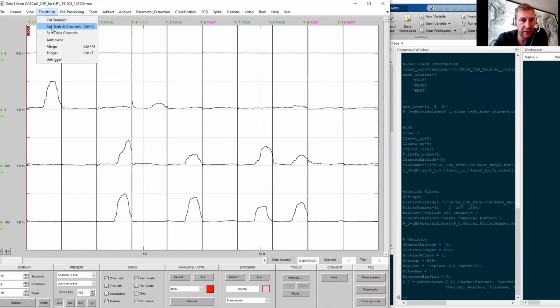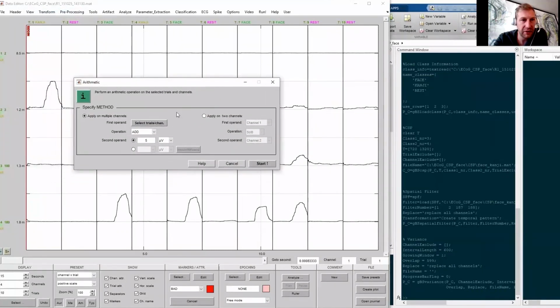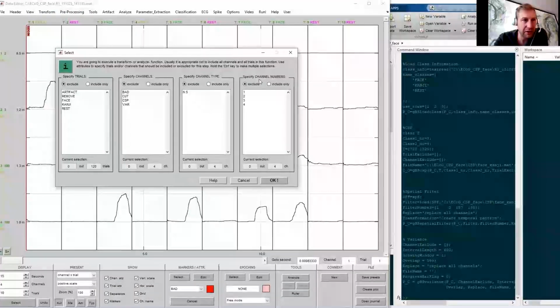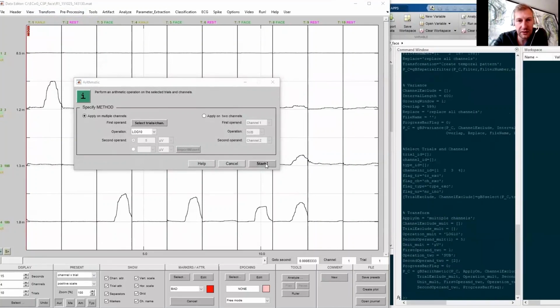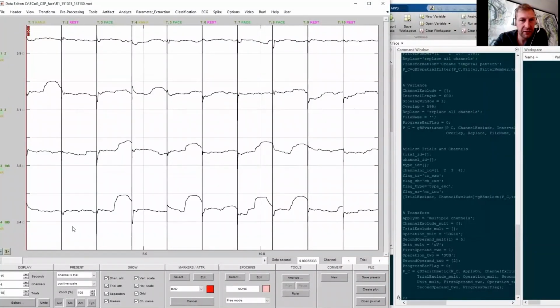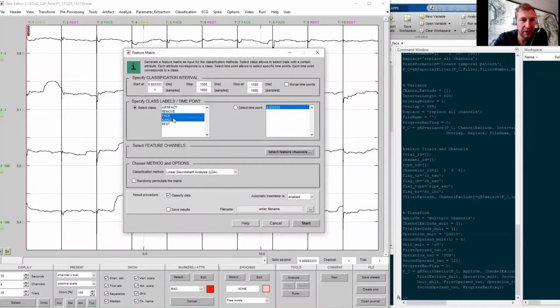And these channels are now representative for different tasks. So you can already see that in the first trial, only one channel responds to kanji. And now we are also normalizing the signal. So after the bandpass filtering, we have the spatial filtering. After the spatial filtering, we have the band power estimation here with a variance estimator. And after the band power estimation, we have the log transformation to ensure that we have a Gaussian distribution of our band power features.